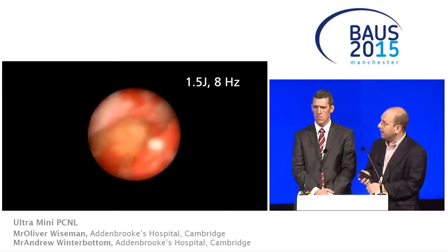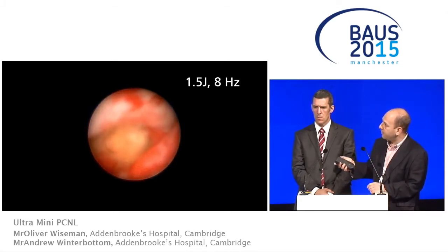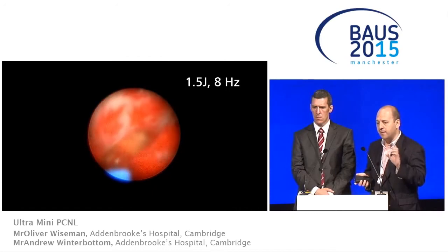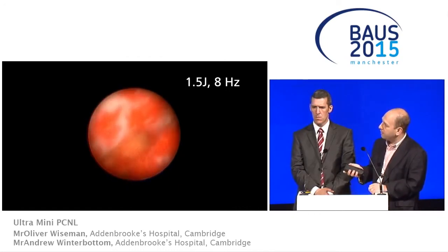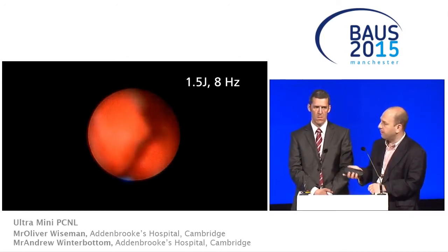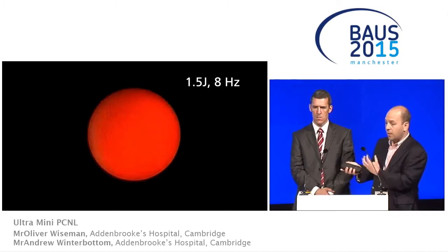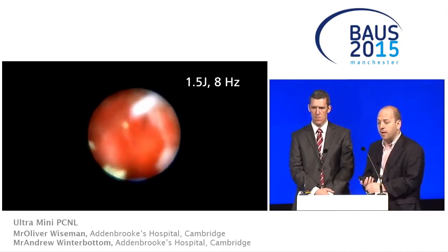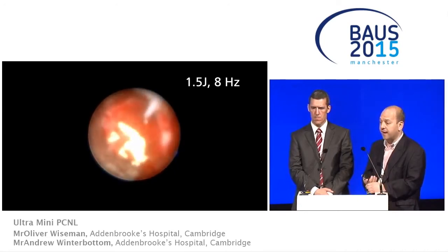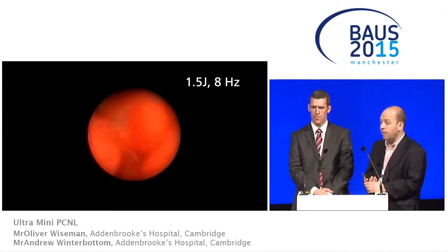There's very little bleeding, and you can see we've got access in through the lower pole here, and the stone is just wedged in that infundibulum between the pelvis and the lower pole. What I was alluding to before is that if you come from above or you've done a lithotripsy on this patient, you can imagine all of these fragments will have fallen back towards where we were, and that's a pretty dependent calyx. I would suggest they would have just sat there and been very hard to clear or access and pick out with a flexible ureteroscope.